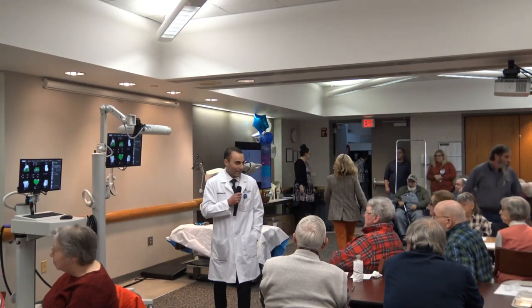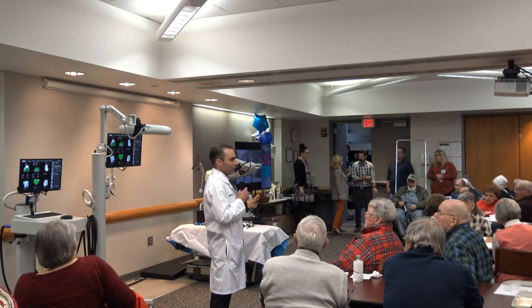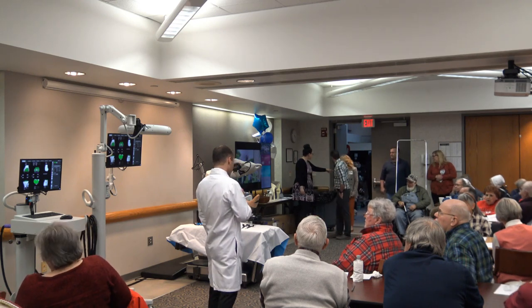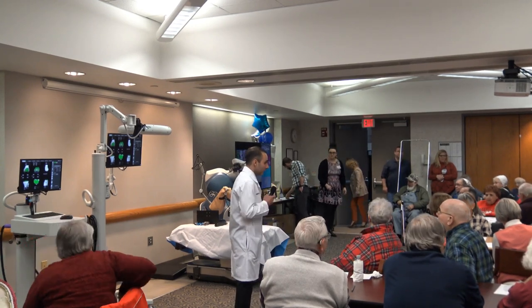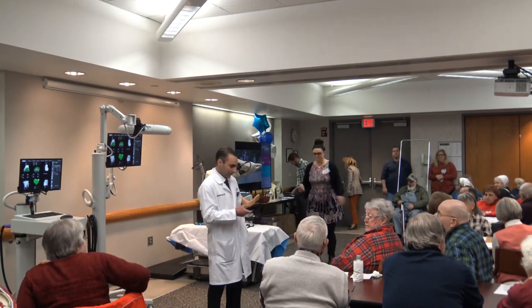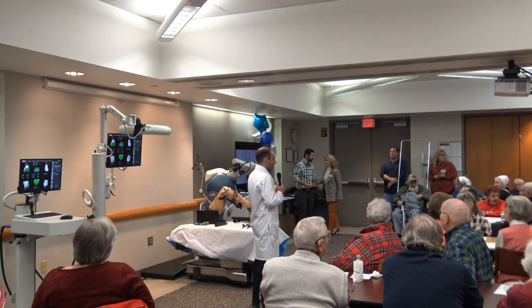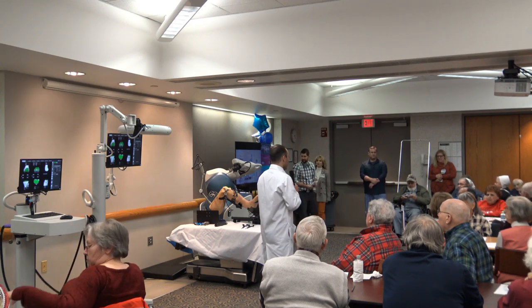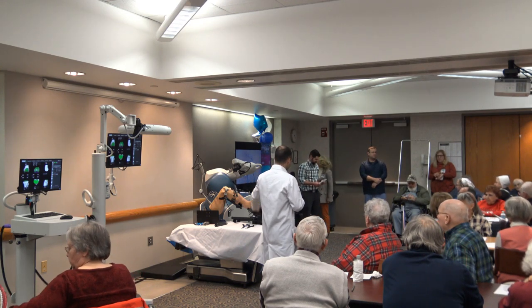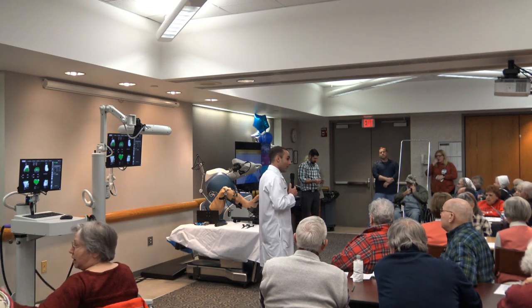Good evening. I'm Dr. Joseph Barruso. I am a board-certified orthopedic surgeon and I am certified in MAKO joint replacement. I'm going to be talking about the technology first, and Dr. Ludverson will talk about patient benefits, and we're going to give you a demonstration on the equipment.